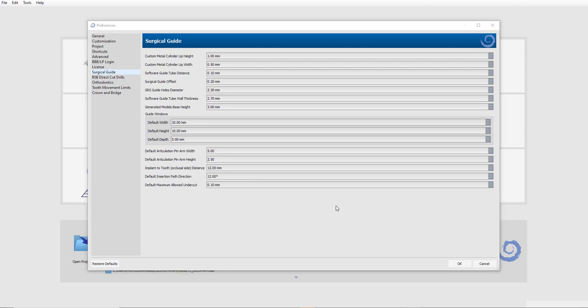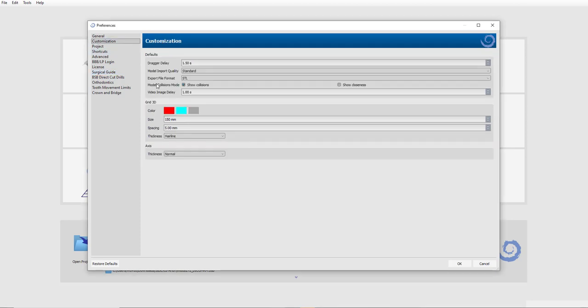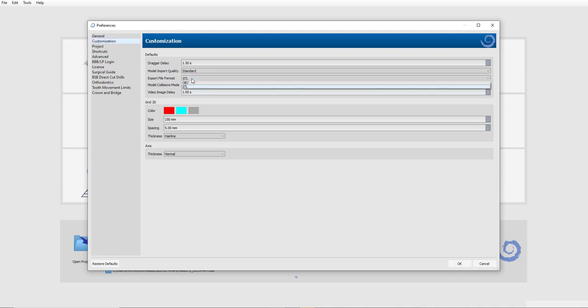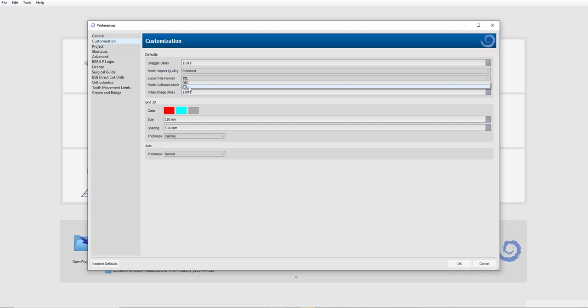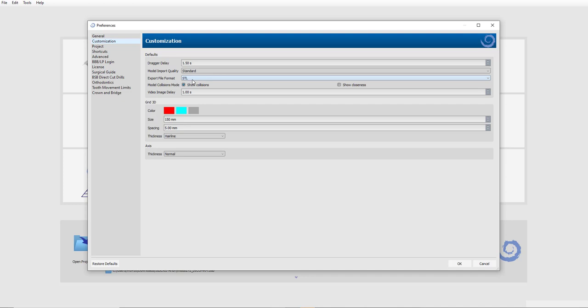In addition, while we're here, let me mention, in the previous release, we changed the export file format by default to be OBJ. OBJ is kind of a more advanced STL file that contains more information. But again, based on user feedback and compatibility issues with other softwares, we have restored the default back to STL.